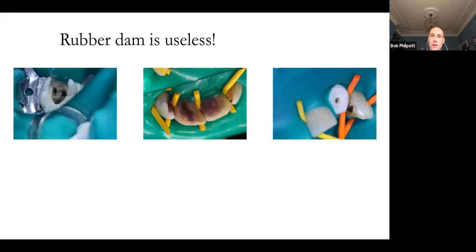Patient gets a shock, you get a shock, and you go, okay, I need to put the rubber dam on properly. To do it properly with multiple teeth, it's hard to use a butterfly clamp in the anterior region. Sometimes what I will use is a deciduous premolar clamp, which is an E-clamp, because it adapts really nicely cervically to especially a mandibular incisor. And it means I can put it right down at the gingival margin, which will mean it's not traumatizing soft tissues, but it's retracting the rubber dam correctly.